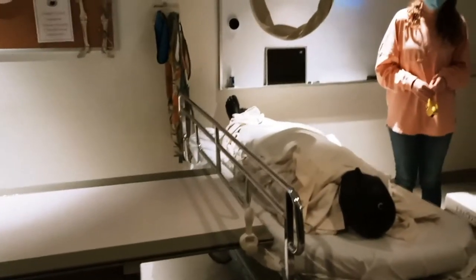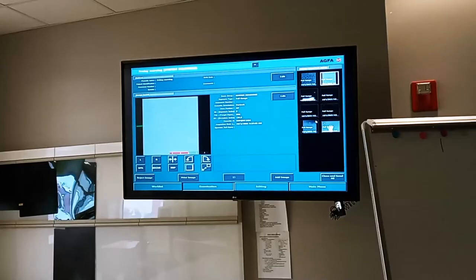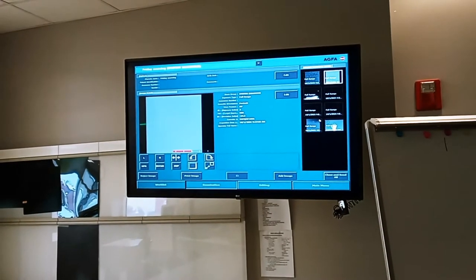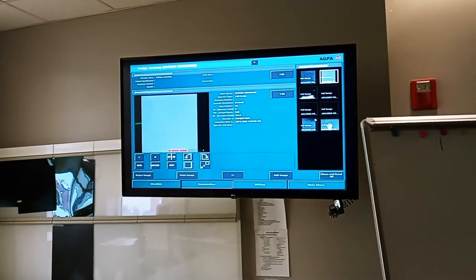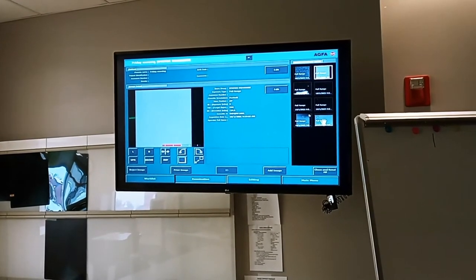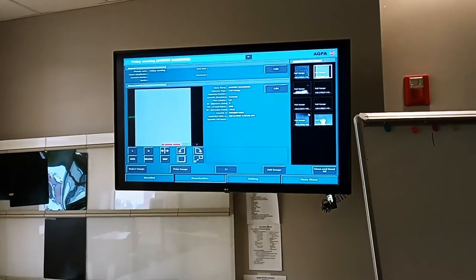The name of the experiment is Shielding on Portable X-Rays. All right, since you're camera shy, step us through these images.